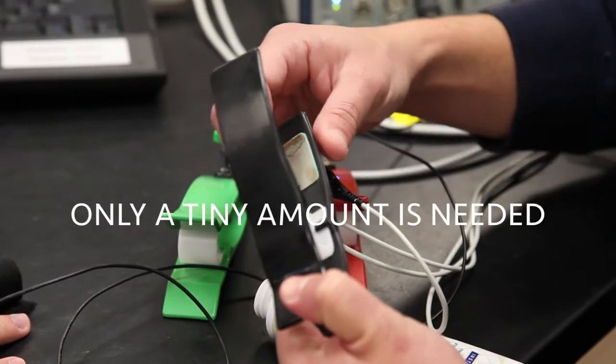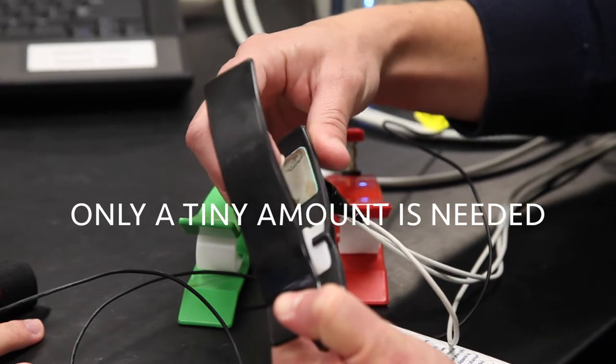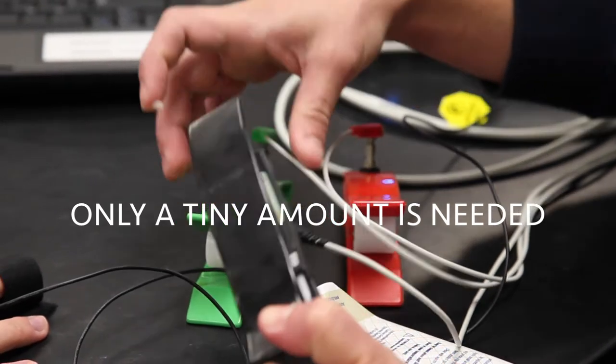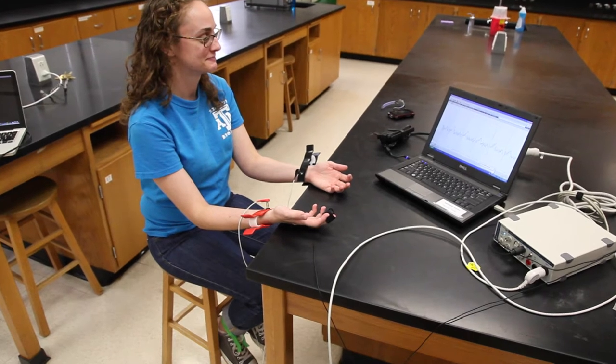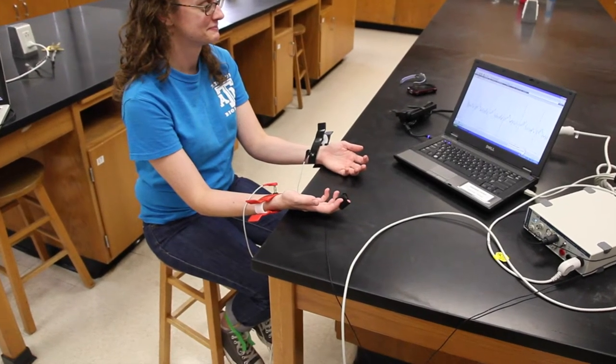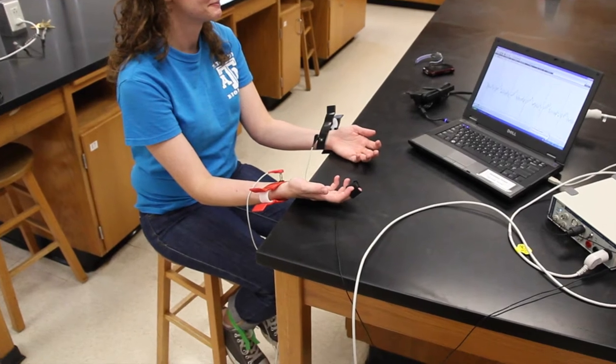Spread a thin film of electrode gel over the surface of the electrodes. Here the black electrode is placed on the left wrist while the red electrode is placed on the right wrist. The green electrode is placed on the right ankle.